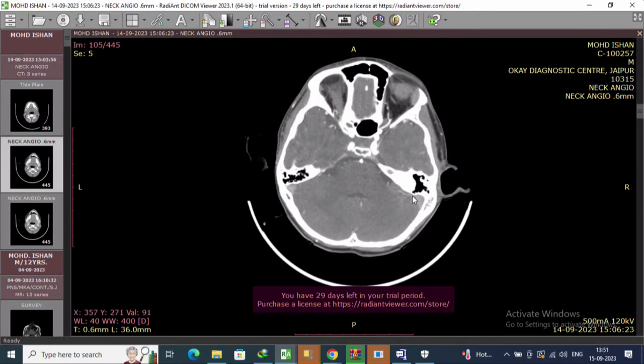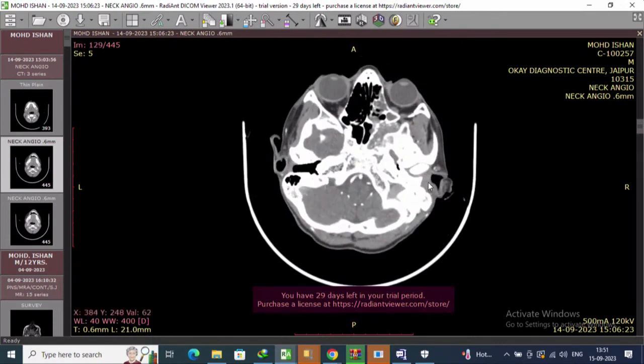So, this is a 12-year-old child. I'll quickly take you through the imaging part. This is the first investigation we order when we suspect JNA. Young male with nasal obstruction, history of bleeding. You immediately suspect JNA as a first diagnosis with a nasal mass on endoscopy behind.